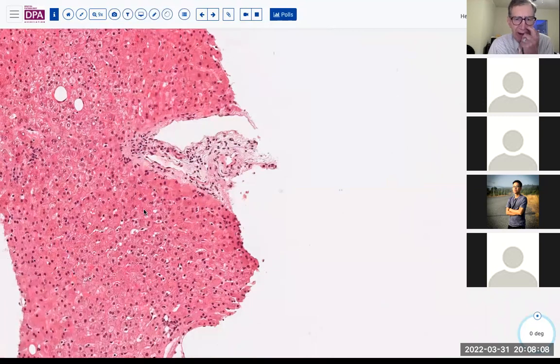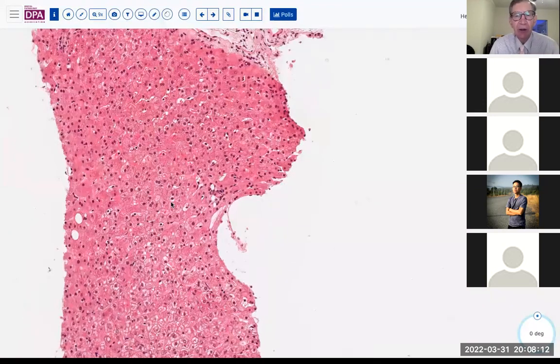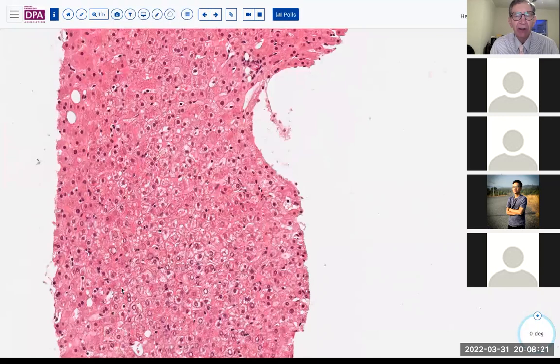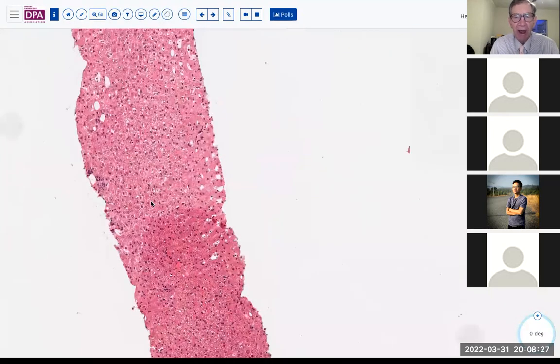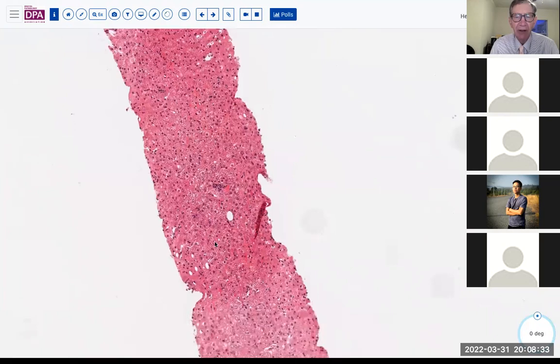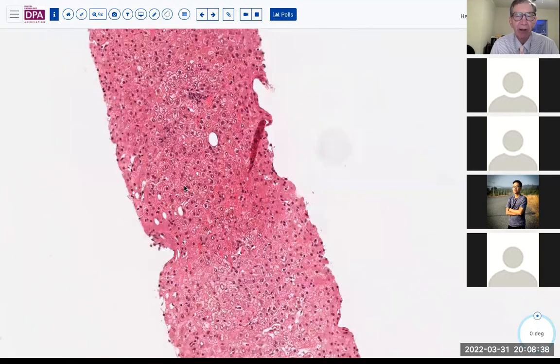Now, with some of these adenomas, the margins are not really distinct. And so you can't draw a line necessarily and say, here's where the adenoma stops and the benign liver begins. And so this is a challenging diagnosis. And it helps to know that there was a mass seen on the imaging, and that the needle tract goes into that mass reliably before you can make that diagnosis.